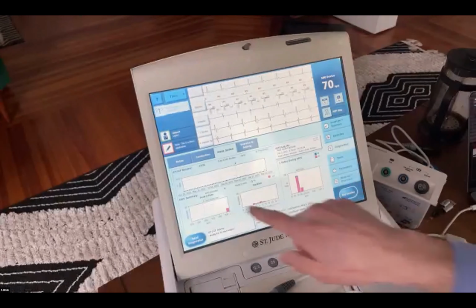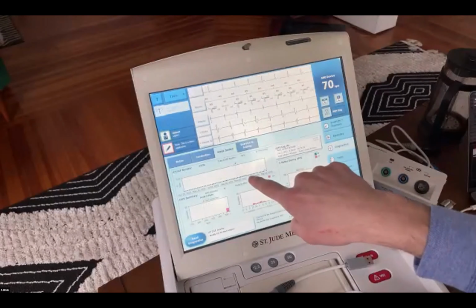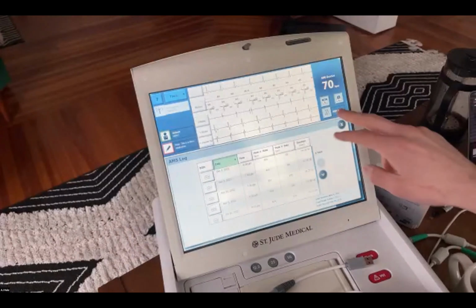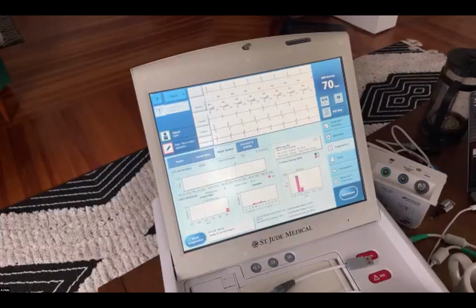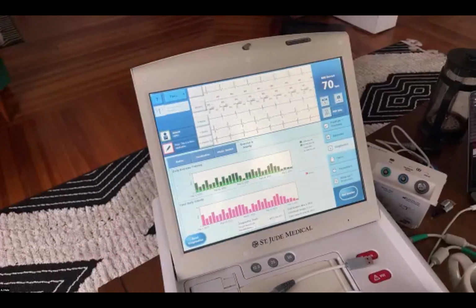Mode switch percentage, this will give you a nice chart of their total mode switch. You can see some slight bumps here and here where they've had higher instances of high atrial rates. It's important to look at these EGMs and make sure that they're legitimate. So here will take me back to that screen. It could be that they have noise because of subclavian crush or something like that. So always just take a look and make sure they're legitimate if you're about to put someone on anticoagulation. Once again, not a physician, so follow any kind of physician direction with that.